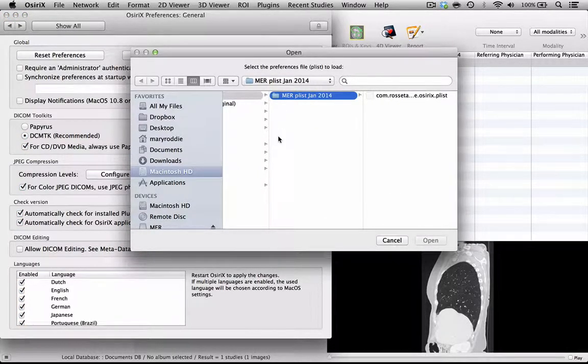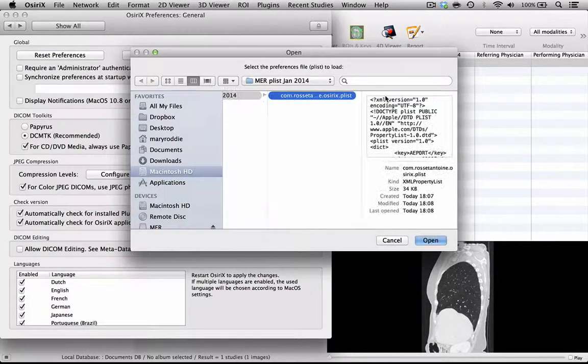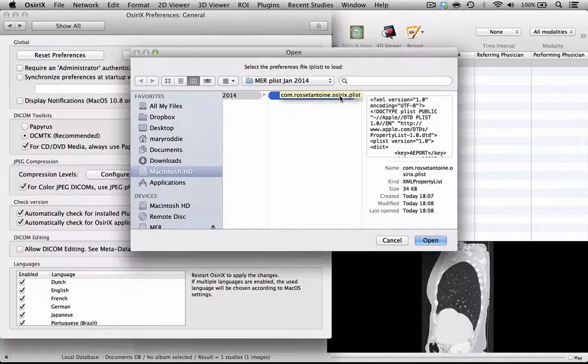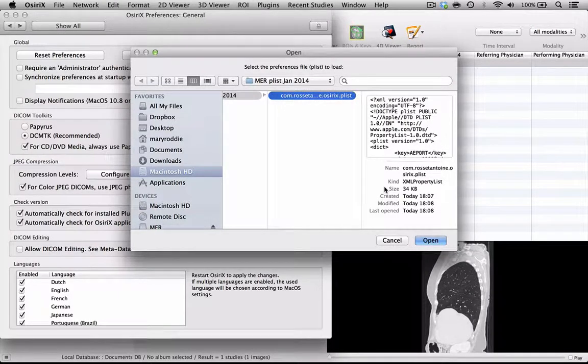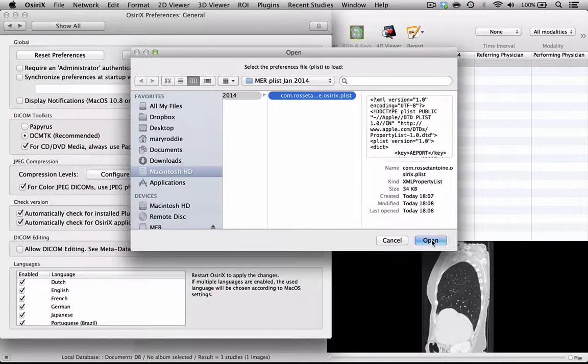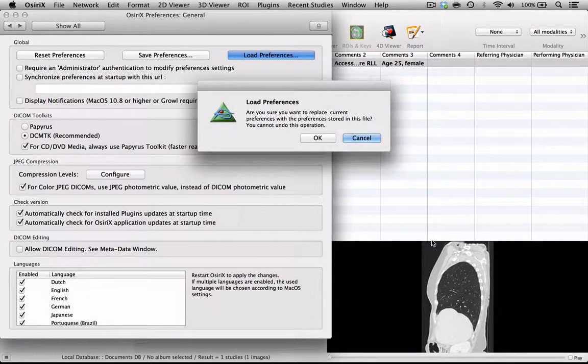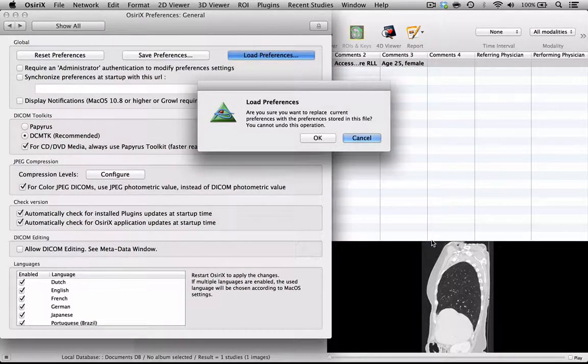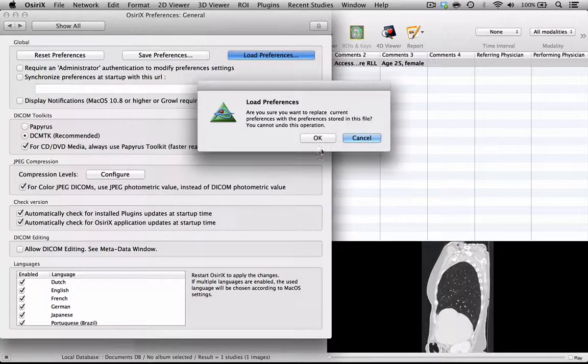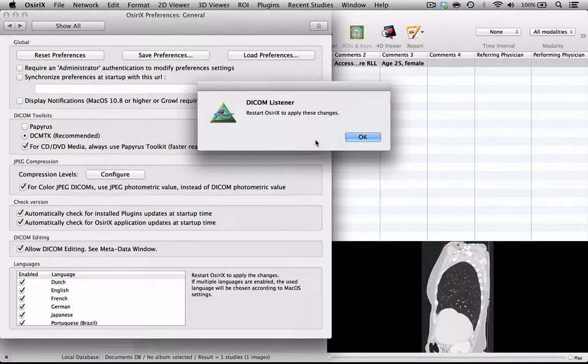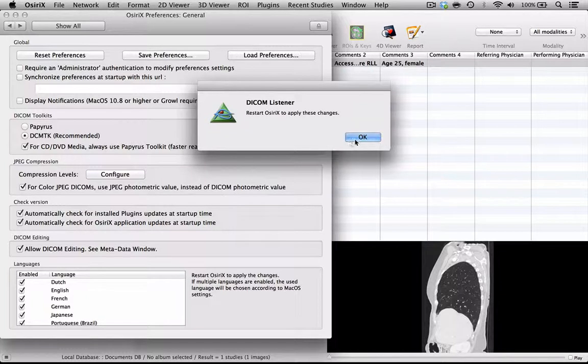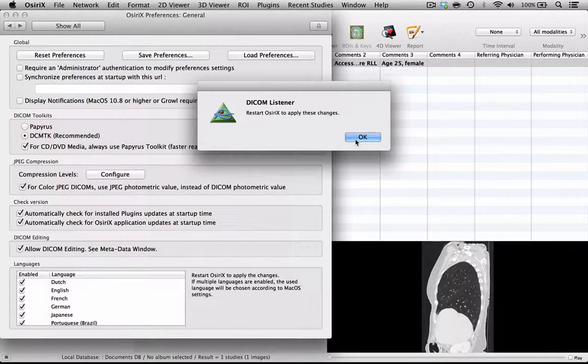I can now go to my saved PLIST file which saves the preferences that I like to use for my teaching purposes, and all I do is open that. The program will ask me, am I absolutely certain I want to do this, and I can say yes I am. It tells me then that I am going to have to restart OSirX for these changes to be applied.